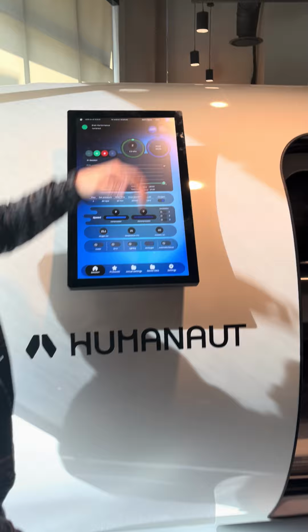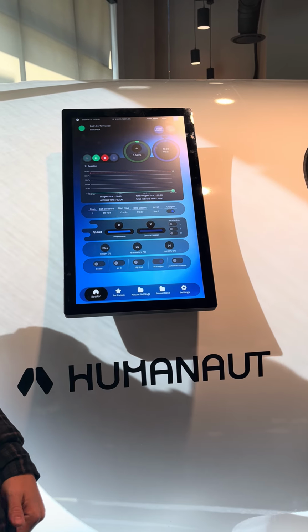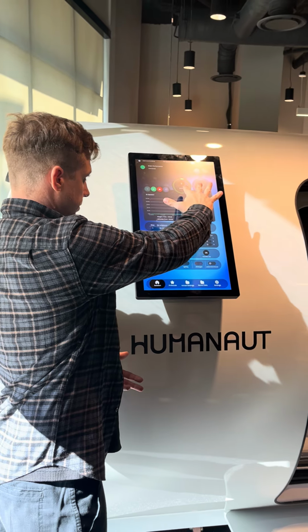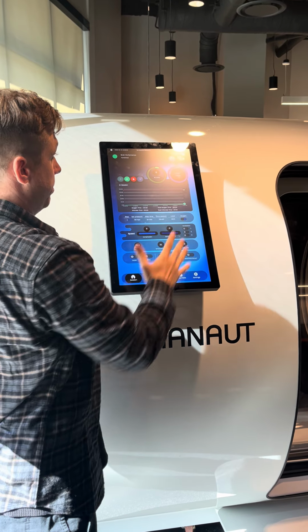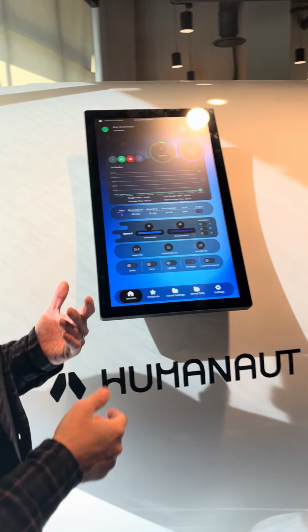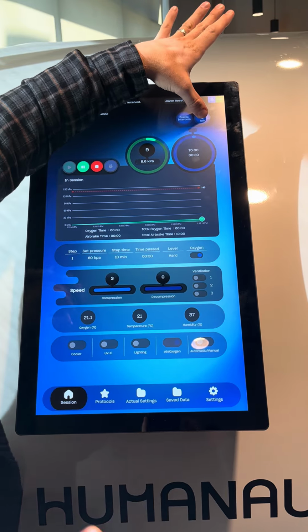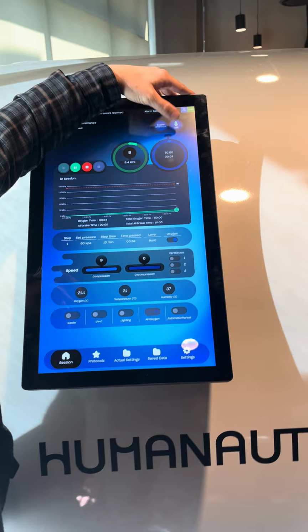Disable the intercom. And then compress it at safe speed. So you have your time here. And safe is 10 kPa per minute. They're doing good. Their ears are clearing. You say, hey, are your ears clearing? Good. If your ears aren't clearing, please knock on the acrylic and I will pause compression.